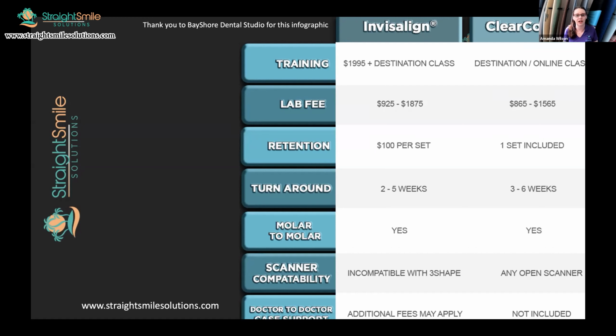It's going to cost you more to get out of trouble. It's not going to happen predictably. Weird things are going to happen because they happen, and the patient's going to be mad, basically. And you're not going to really save that much money because you're going to end up spinning your wheels. So do everything as comprehensive, your first 100, 200 cases, until you get so much more relaxed. Take your time.